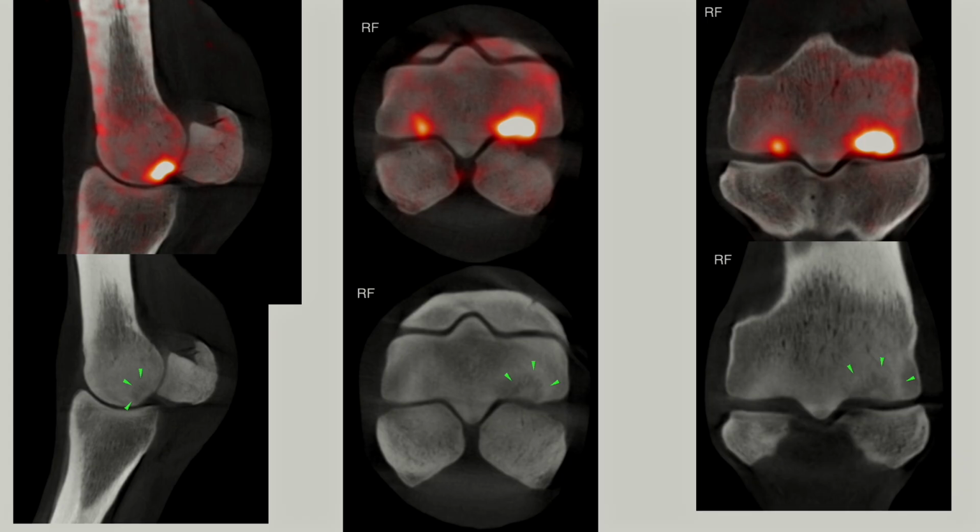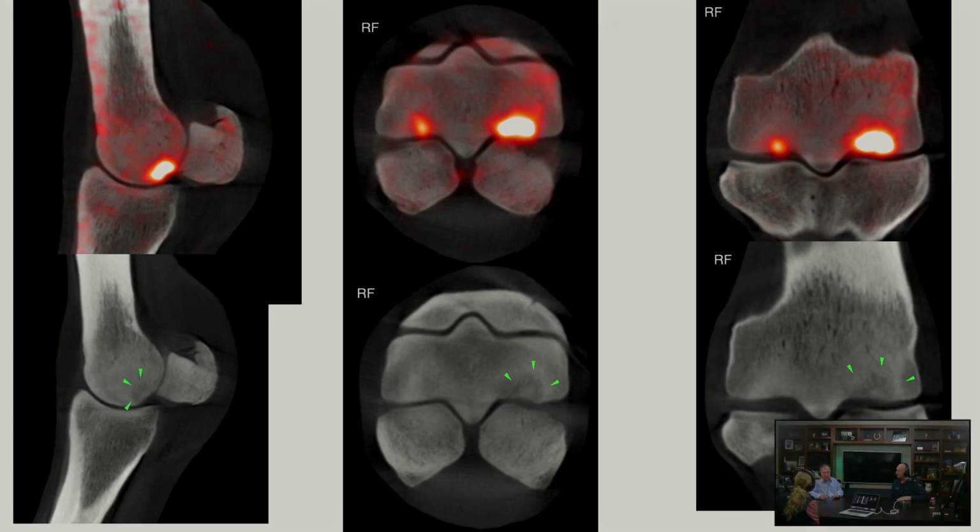But yeah, for the people that couldn't see the images, the red really stands out from the tissue around there. There's a little bit of a smattering of red, but those images you're showing, that is really lighting up. So this is a really good one for anybody that's listening to actually come and have a look at the YouTube. Are they all that positive? Or are you getting more subtle changes? Did you show us one that was extreme there, or is that fairly typical?